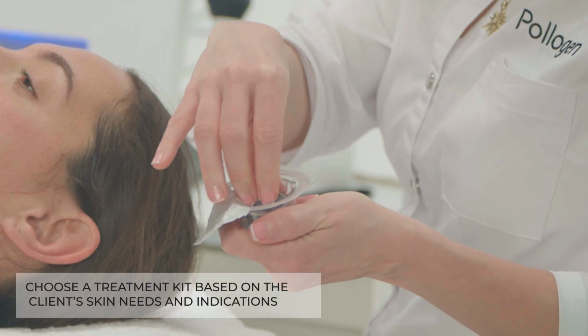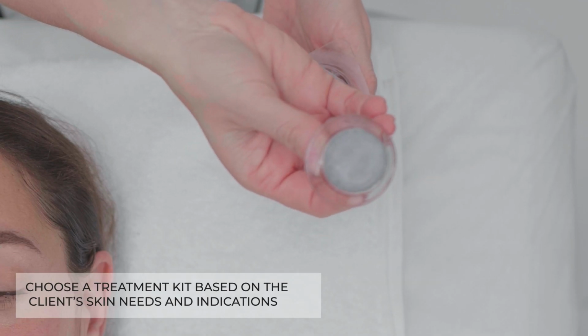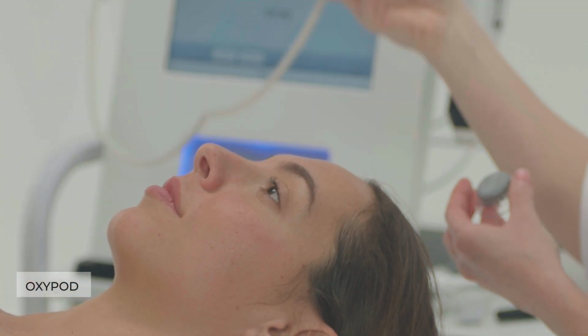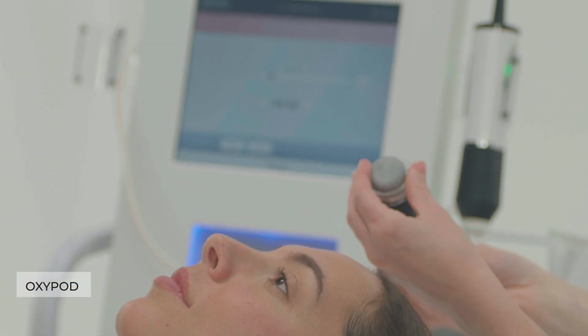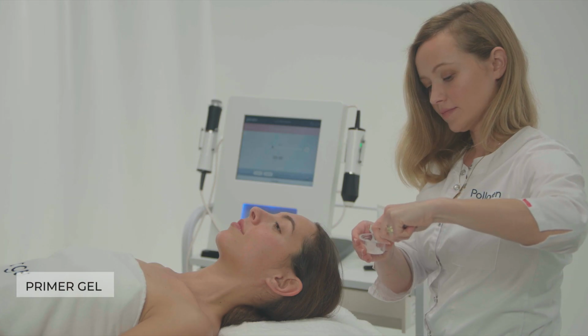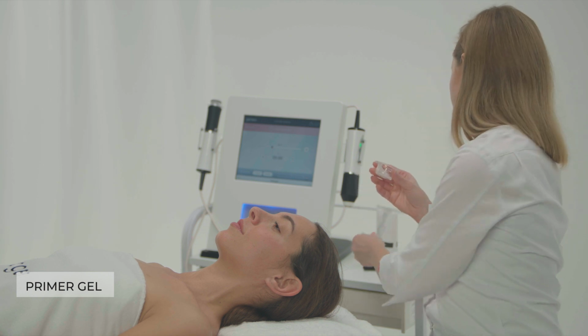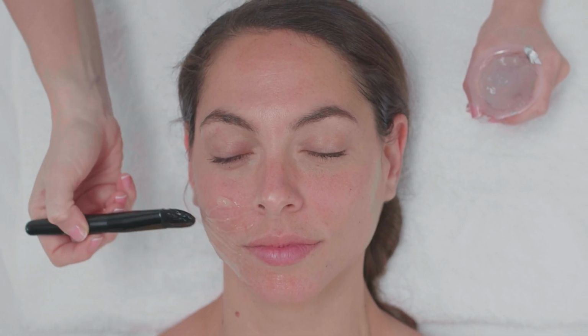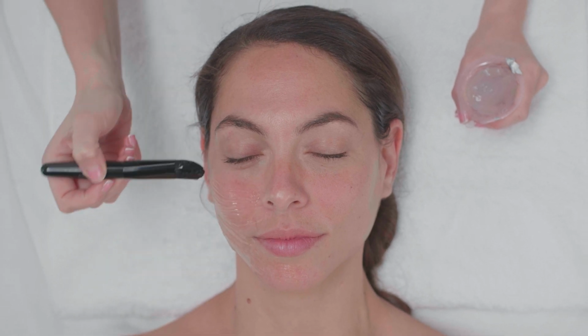Choose the right treatment kit based on the skin analysis and indication. Attach a new single-use OxyPod to the OXYGENEO applicator. Open a sachet of the primer gel and squeeze the contents into a clean bowl. Apply a thick layer of the gel using a brush on the entire treatment area.